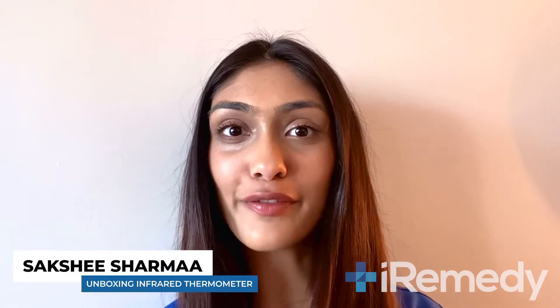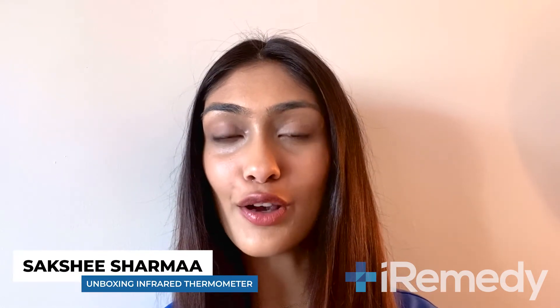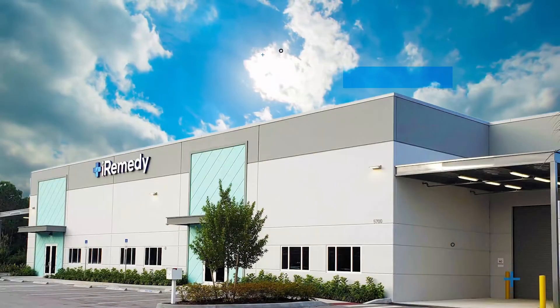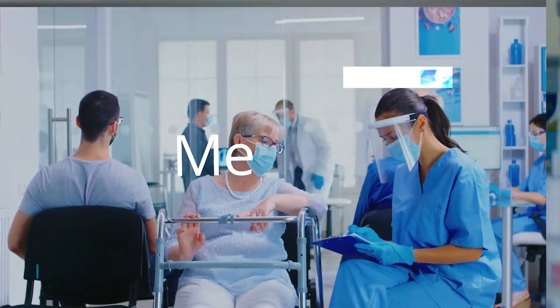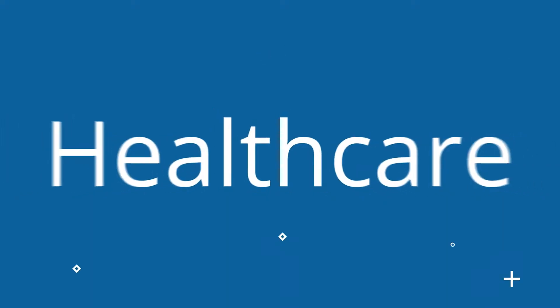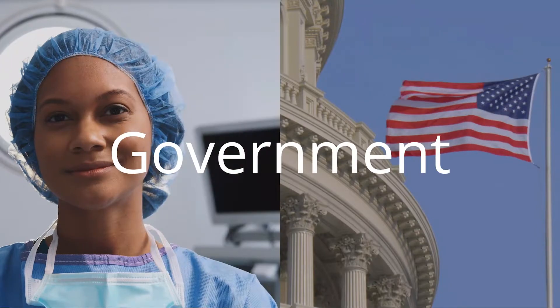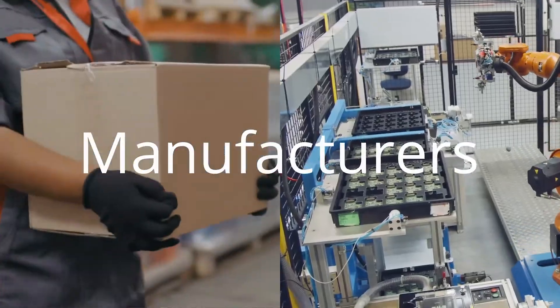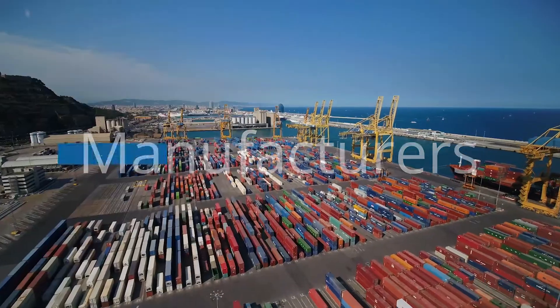Hi, I'm Sakshi Sharma from iRemedy and in this video I will be unboxing the infrared thermometer. iRemedy is a medical supply company with the world's largest online catalogue of health and medical products. We ensure safety by working exclusively with established, verified manufacturers and distributors that offer FDA-approved products.